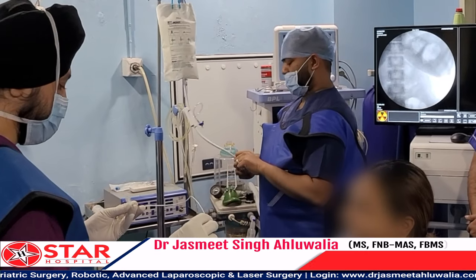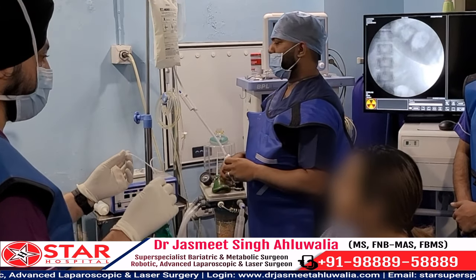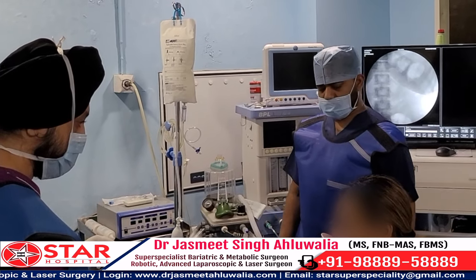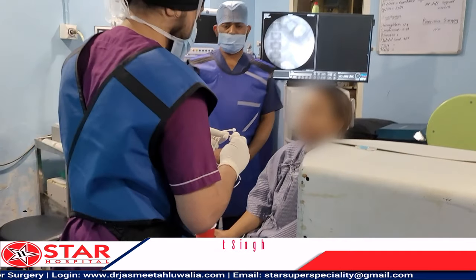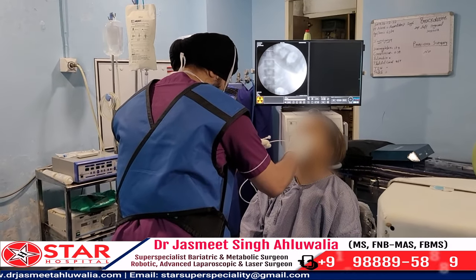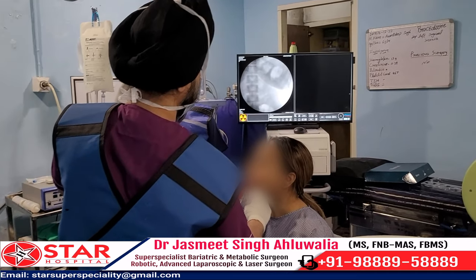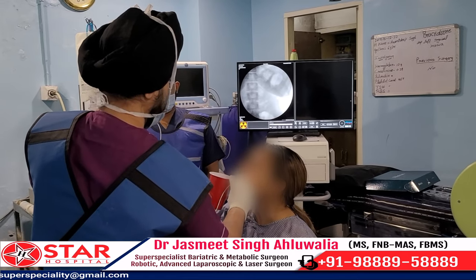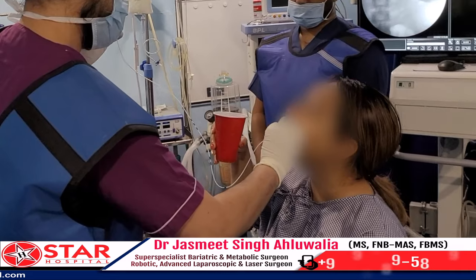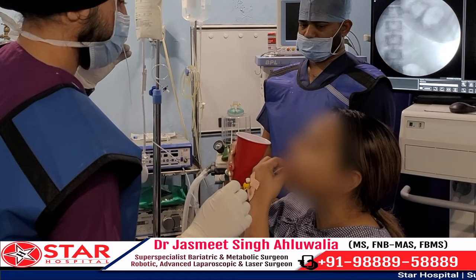We explain the procedure to the patient first so that the patient is very comfortable and cooperates well when we are going to insert the balloon. We ask the patient to wet her mouth so that the mouth gets lubricated, and then we place the balloon right at the very back of the mouth and ask her to swallow the balloon with a big gulp of water.